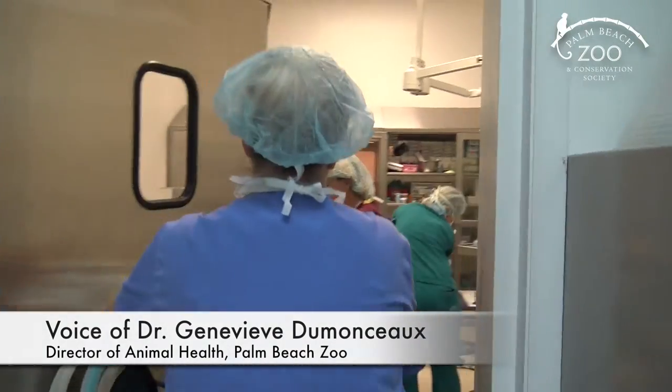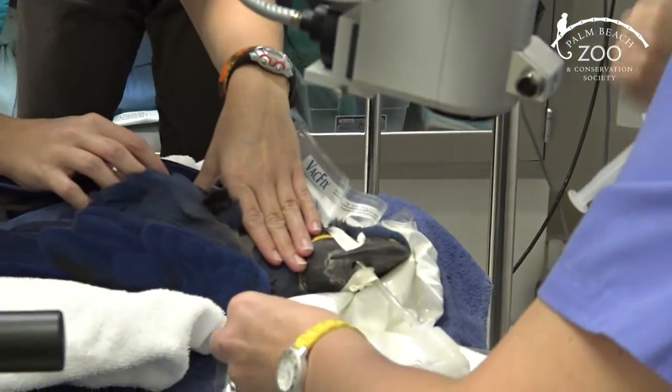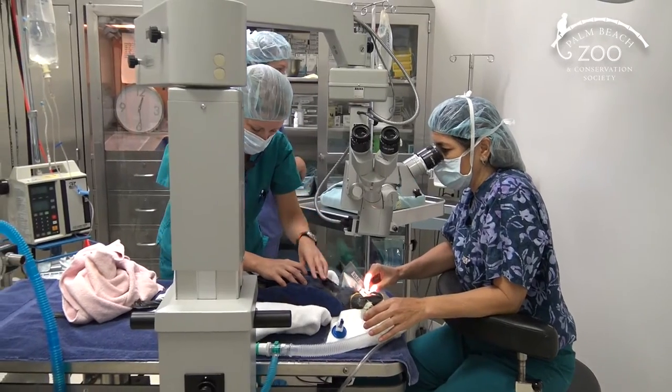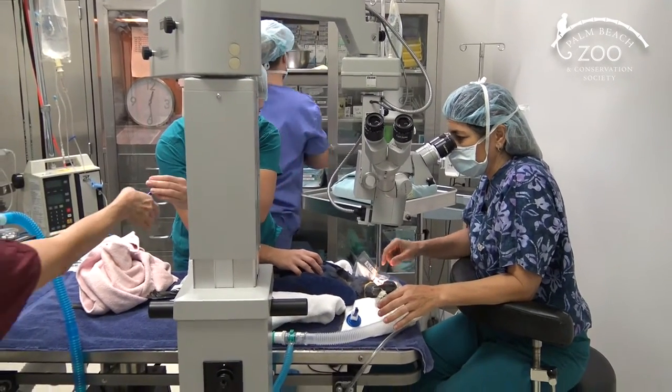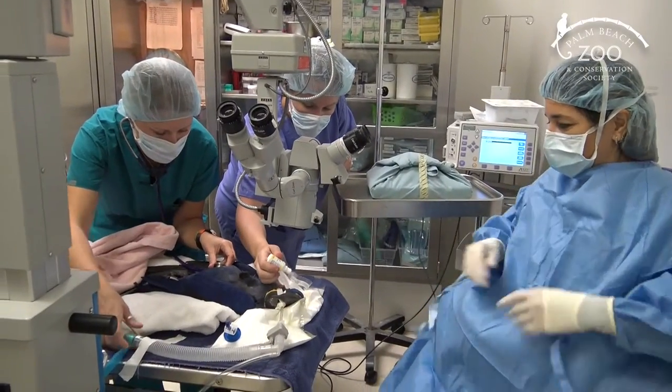This is the very initial stage of Paris's preparation for cataract surgery. Behind the microscope is Dr. Susan Karastro, a board-certified veterinary ophthalmologist, getting ready for the sterile surgery.